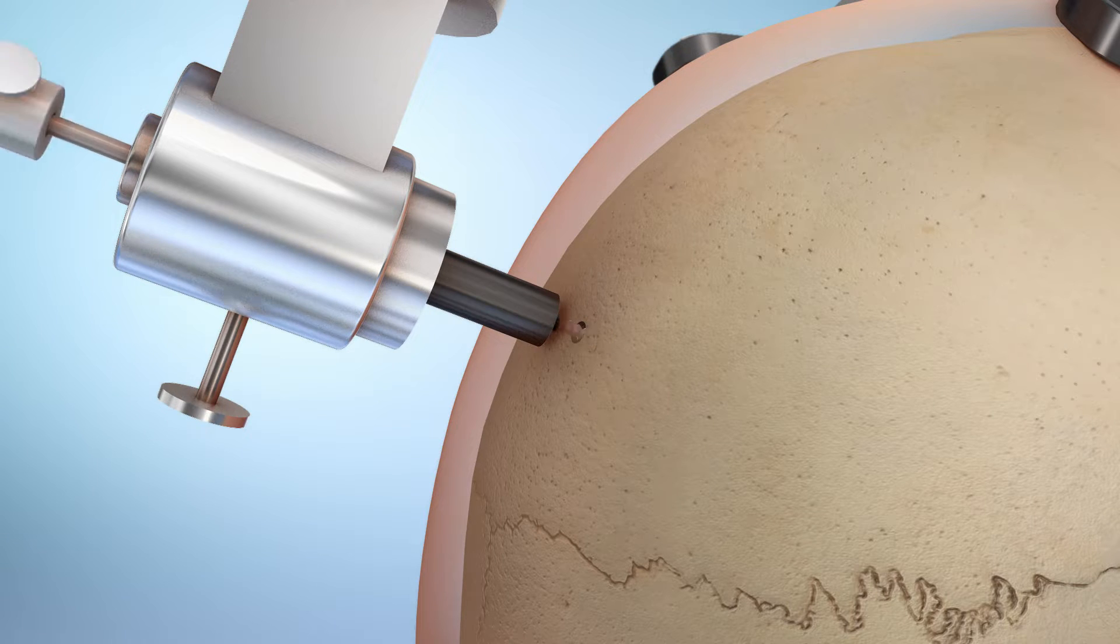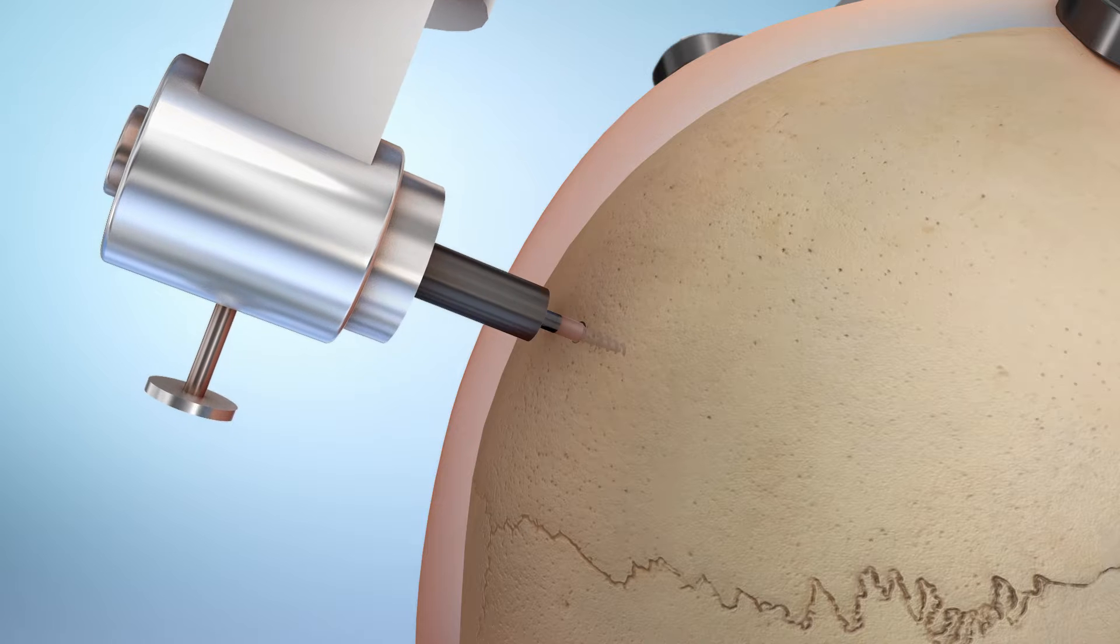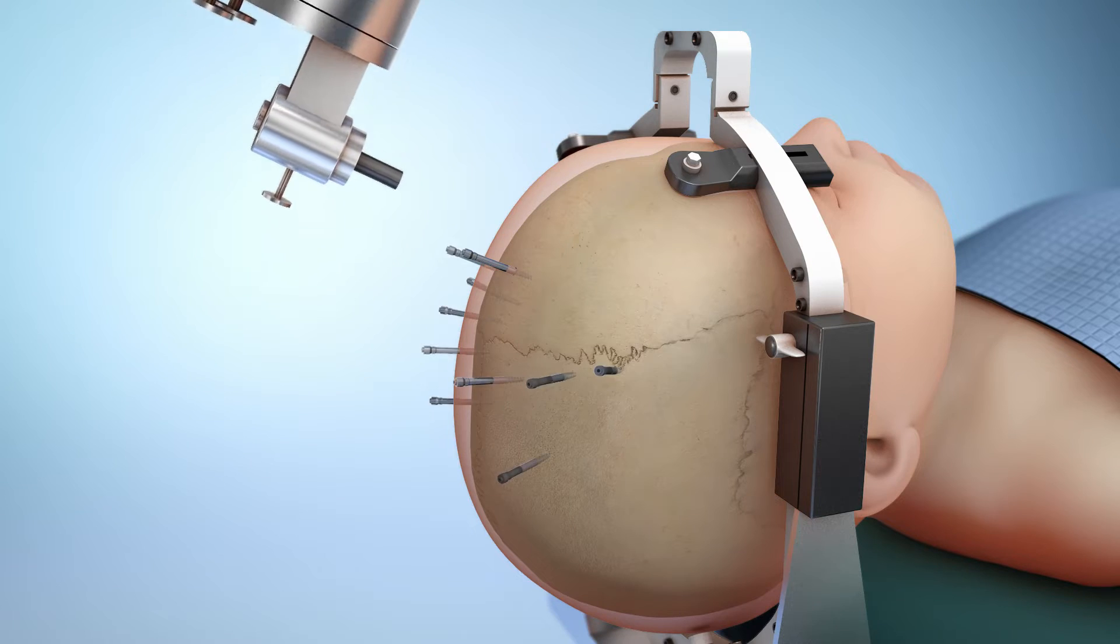Then, an anchor will be placed in the hole. This process will be repeated until all the holes are made.